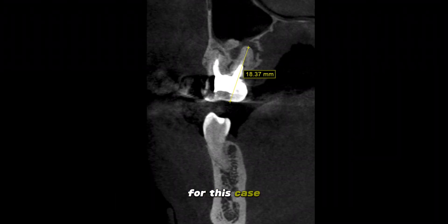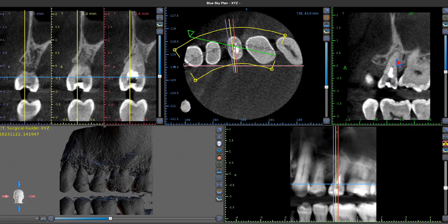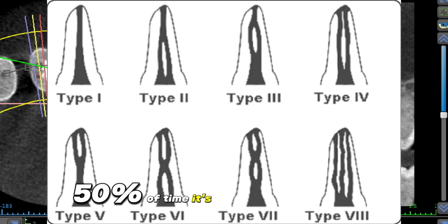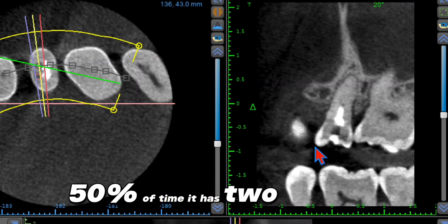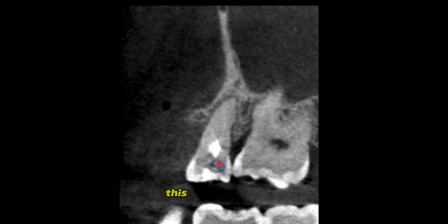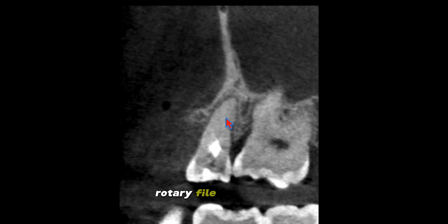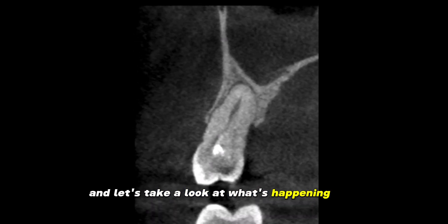We're using Blue Sky Plan for this case, looking at tooth number 25 — the 50-50 premolar. 50% of the time it has one canal, 50% of the time it has two canals. This case was referred to me because the provider got stuck about here, took their rotary file to this point, and could not make it further. So I took a cone beam and let's take a look at what's happening.